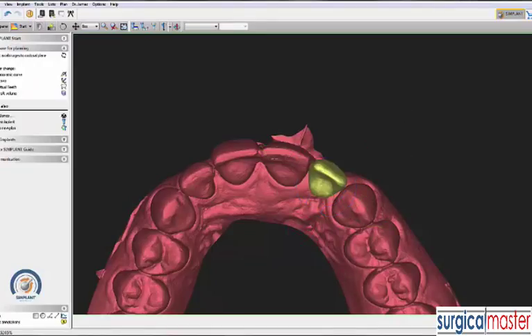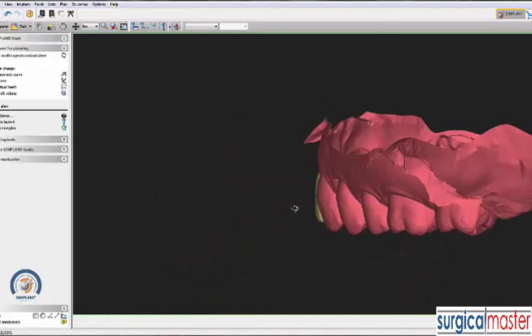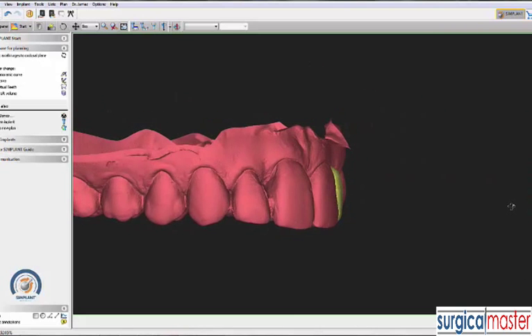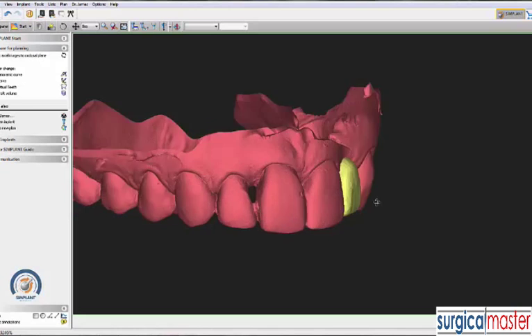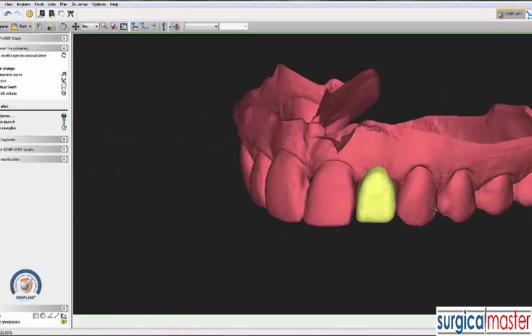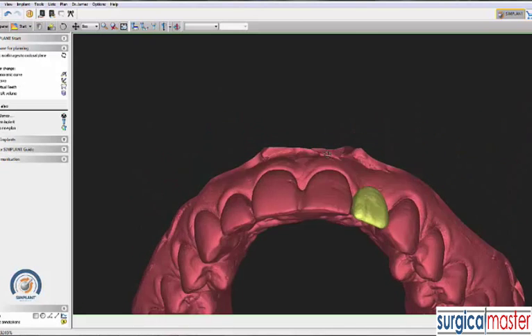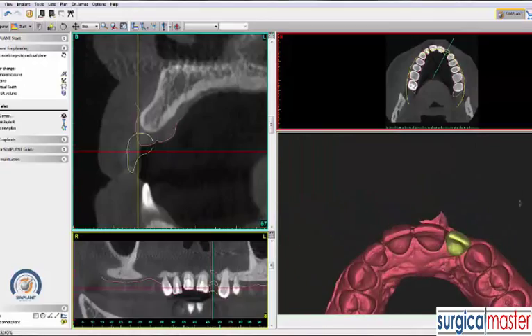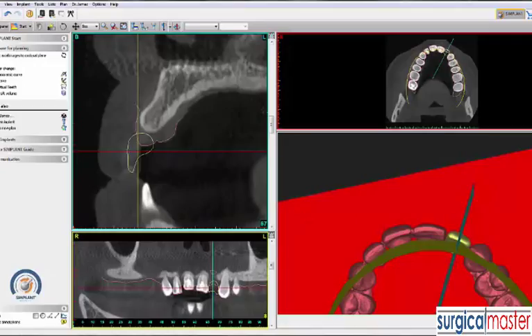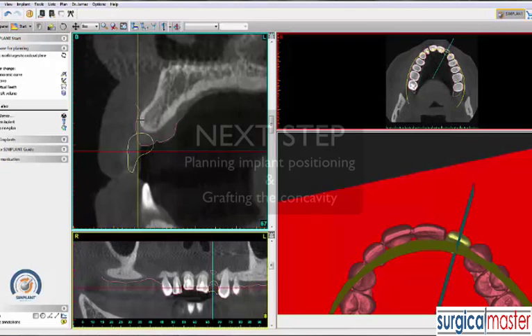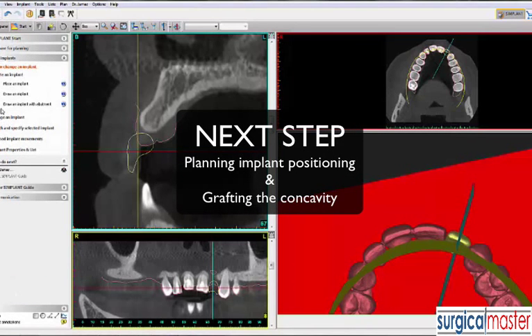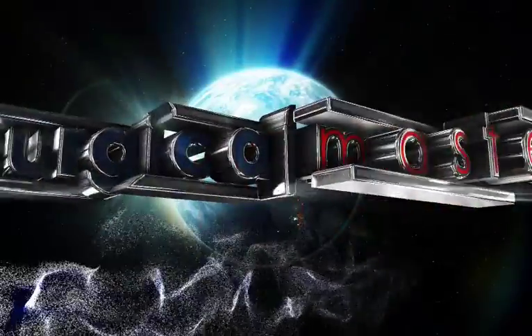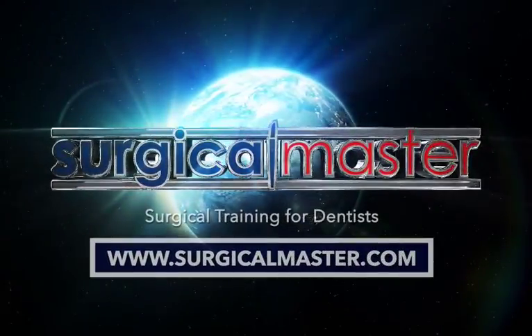I'm looking at the incisal edge to make sure it's continuous. I can also look from the buccal aspect to make sure the contour of the tooth is proper, except for the emergence profile which is currently deficient. This tooth will likely end up being a little bit longer than number 7, but that's quite good. We pick a cross-section through the virtual wax-up, and in the upper left we can see the cross-section of the tooth, the soft tissue in pink, the bone, and the concavity as well.